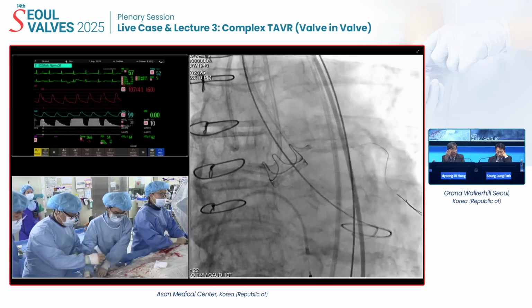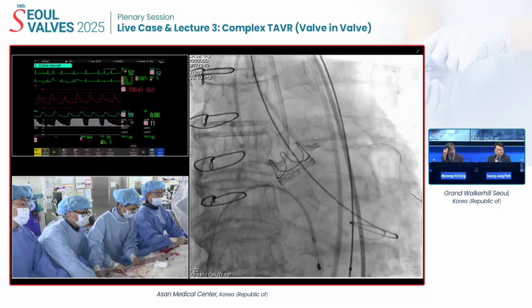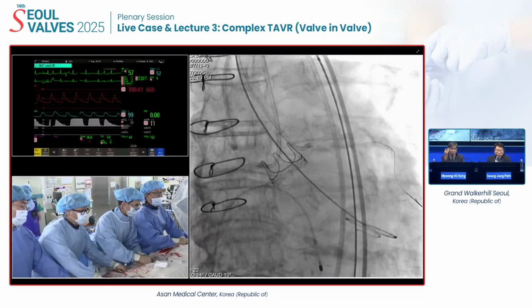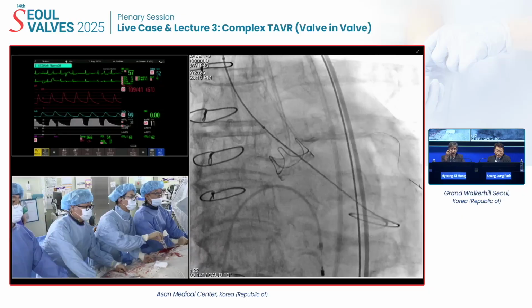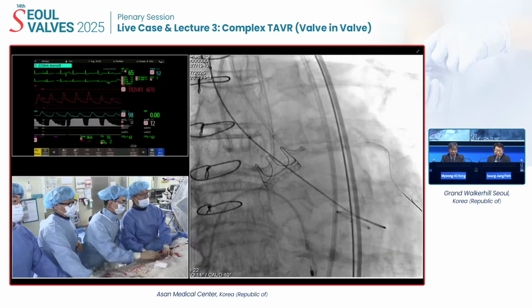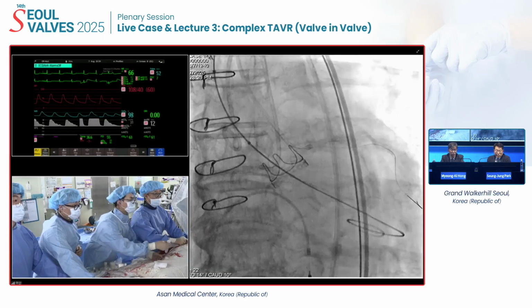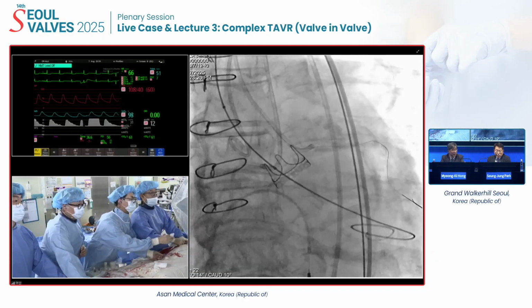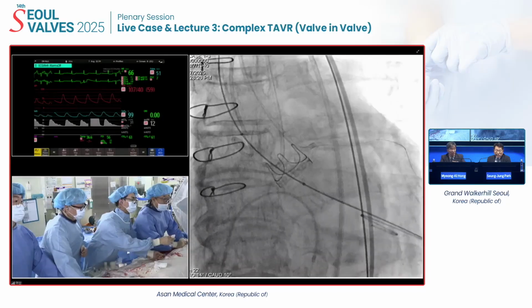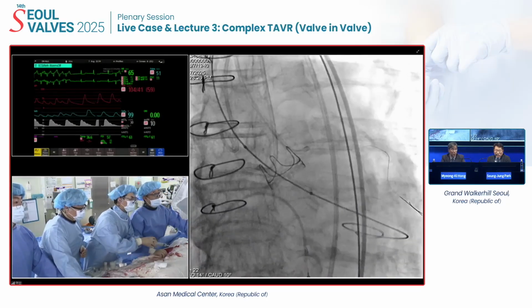It is bulky, and surprisingly it emboli to the brain. Personally, I think this kind of patient is an absolute indication to use a Sentinel. Additionally, if you do the predilation, with every touch the risk of stroke increases more and more.